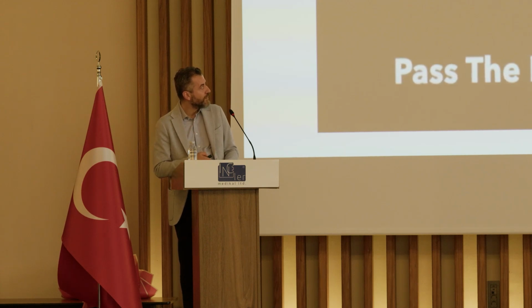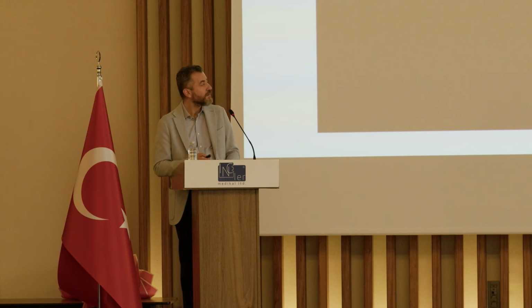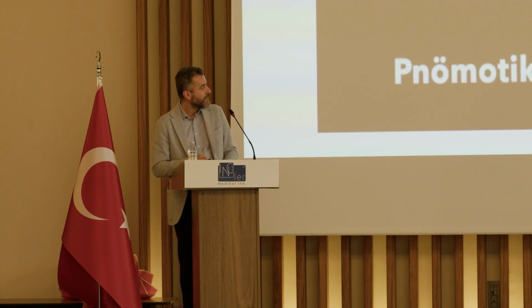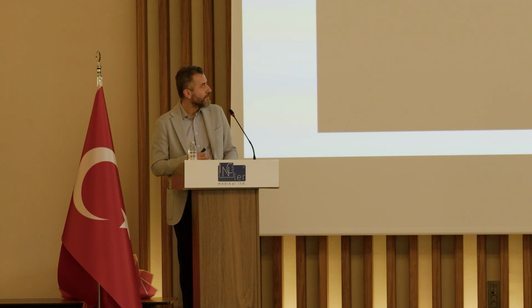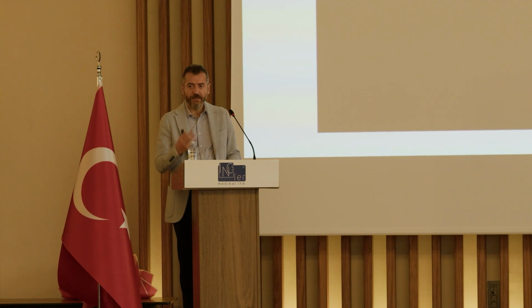And this is a huge one that we cannot take in one piece. So we apply ballistic pneumatic lithotripsy. We just apply the force on the stone, it breaks, and the pieces are taken out. In the end, in order to establish the complete stone clearance, we need to have efficient lithotripsy.